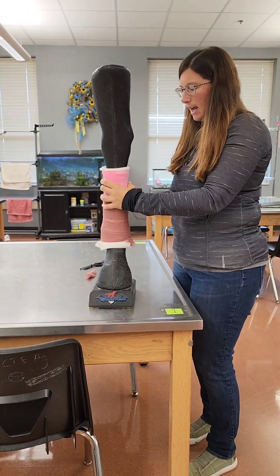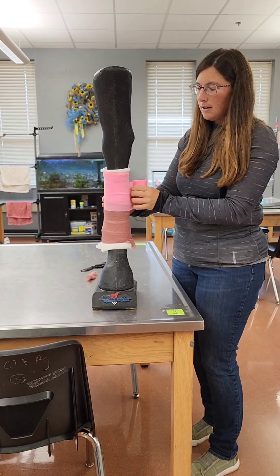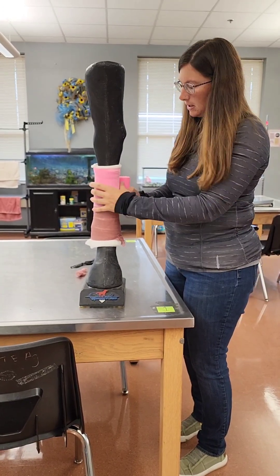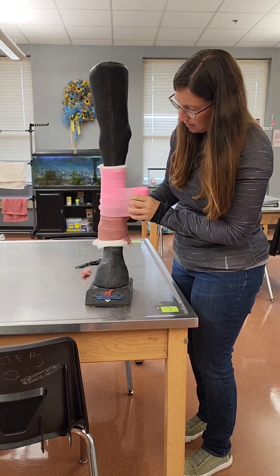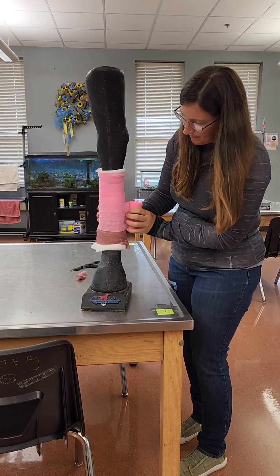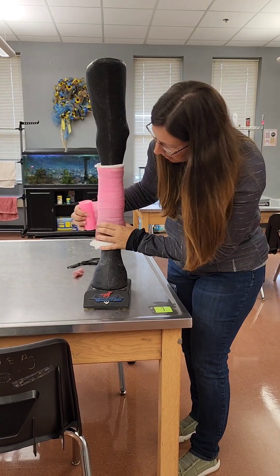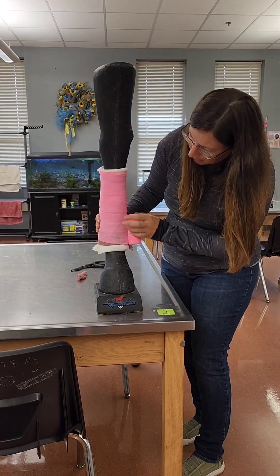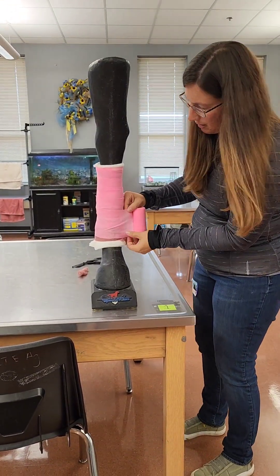Pull to about 50%, and the same as all the rest of the layers, we want to make sure that we are pulling across the front and applying equal, even layers that are wrinkle-free — which is very difficult with vet wrap because it sticks to itself. You are going to come all the way down the leg, and your layers should be about half width.